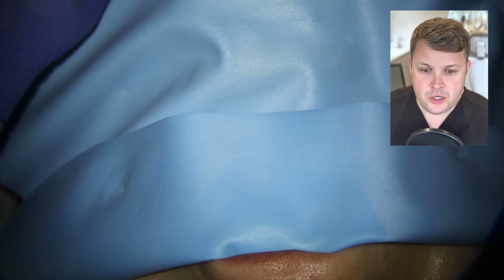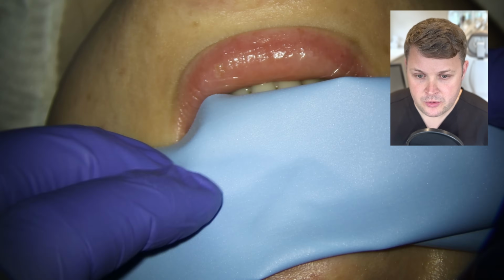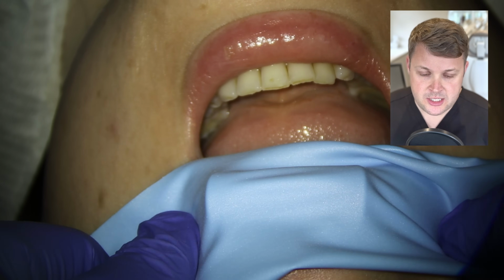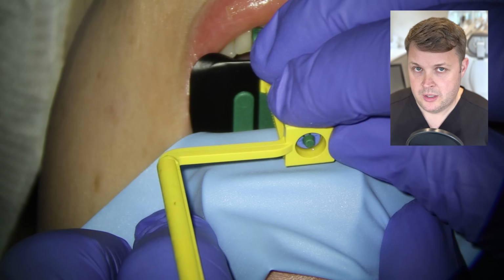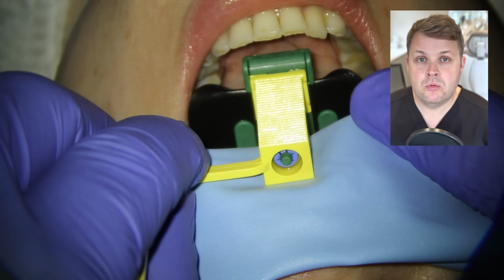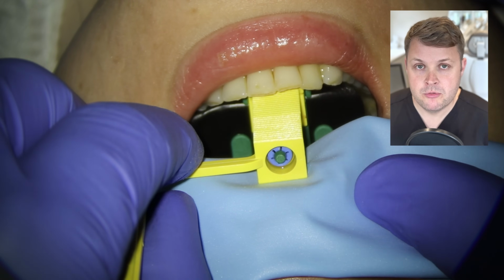We're then going to take our cone fit radiograph. I like to cut the excess off the GP cone for a number of reasons. And essentially when we're taking an x-ray, what I like to do is I obviously like to remove the frame. I fold the rubber dam so I can see the frame through the rubber dam.